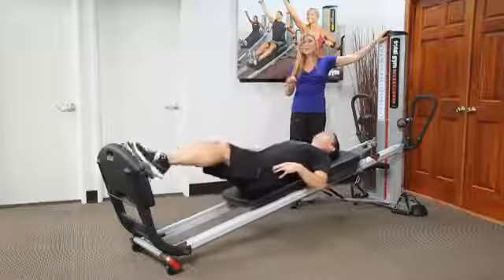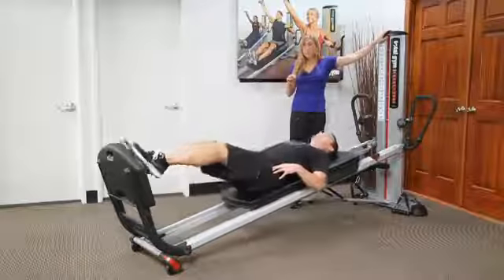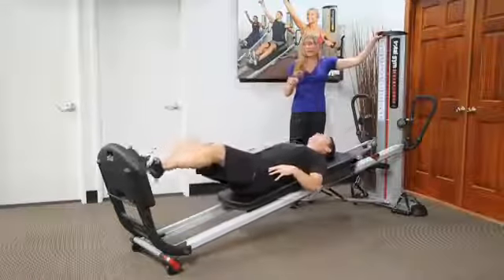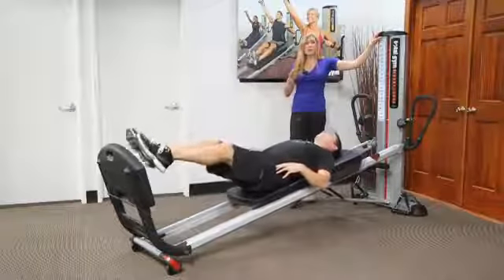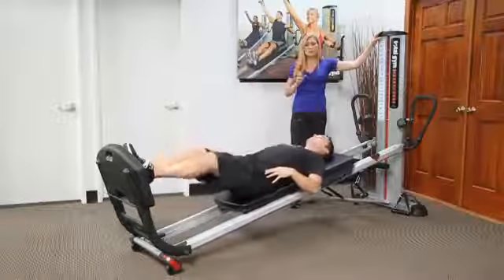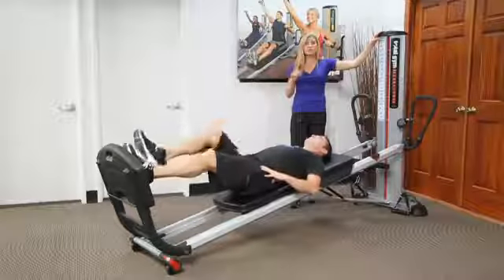The exact incline level will be dependent upon your patient. Jumping for stabilization is great — it's like jumping on a reformer with a low load. It's very similar in terms of how it transforms into more of a stabilization exercise.